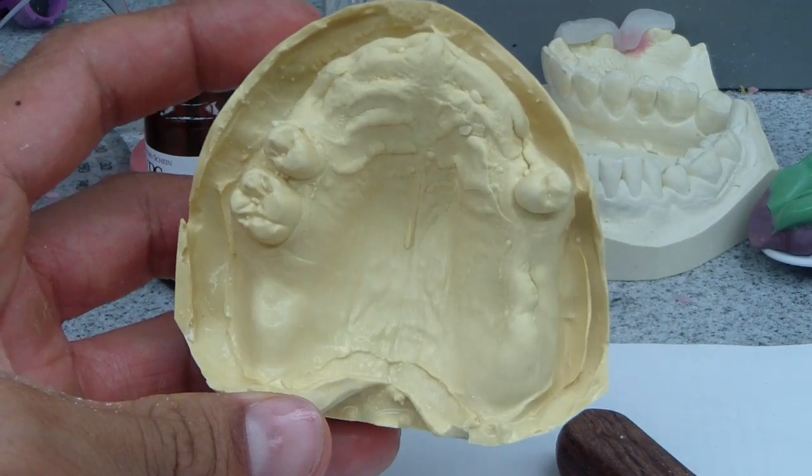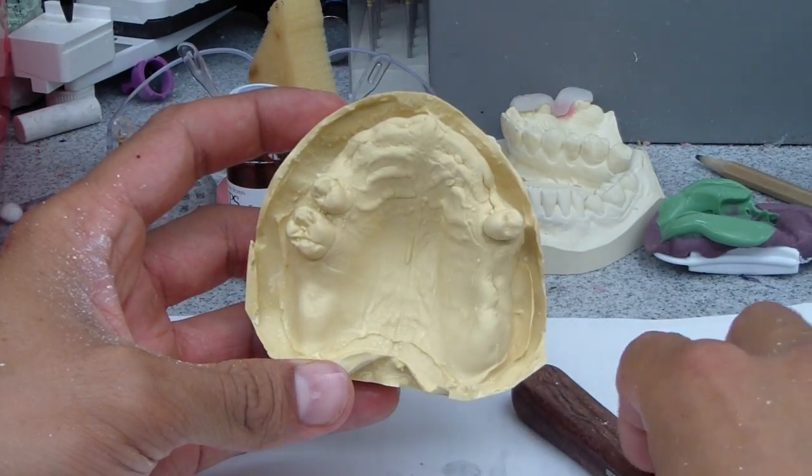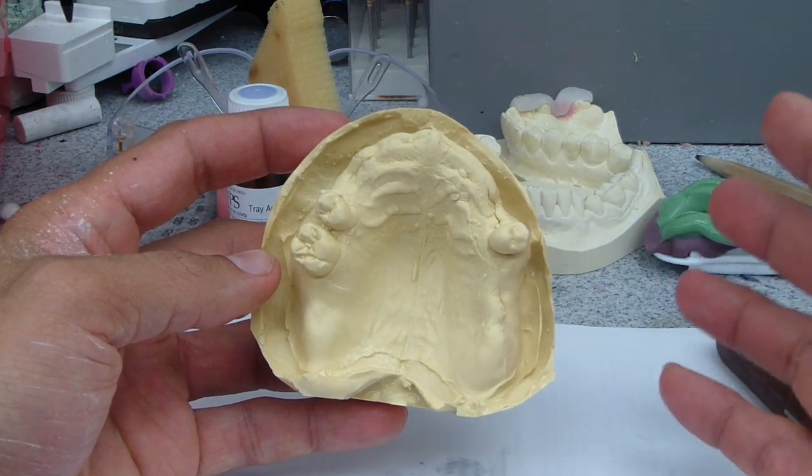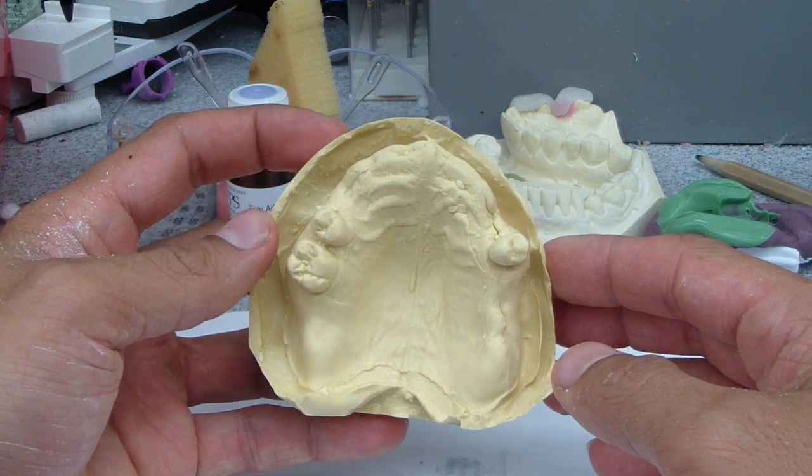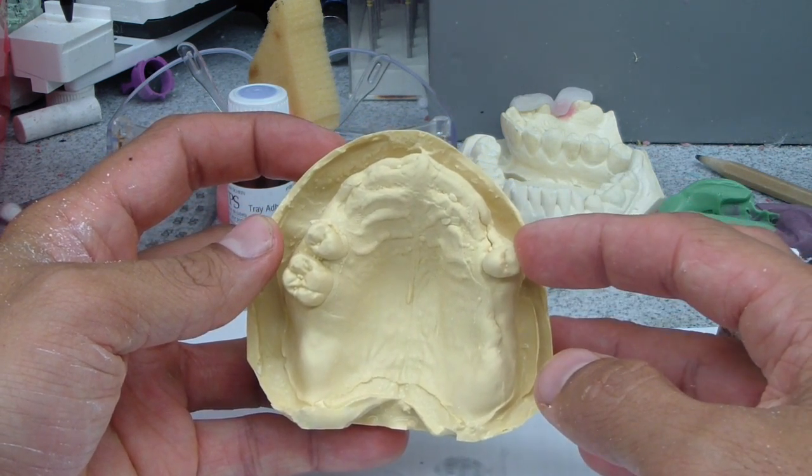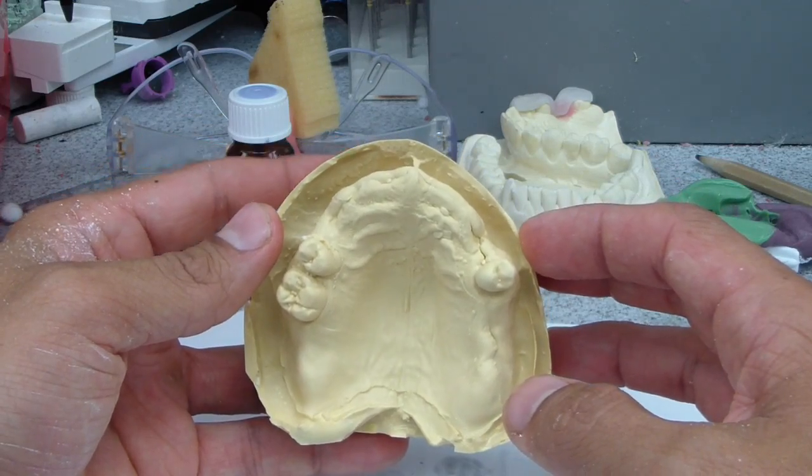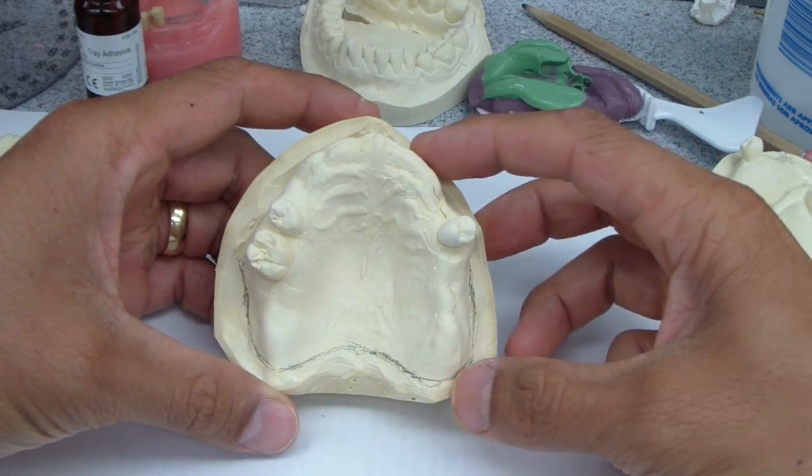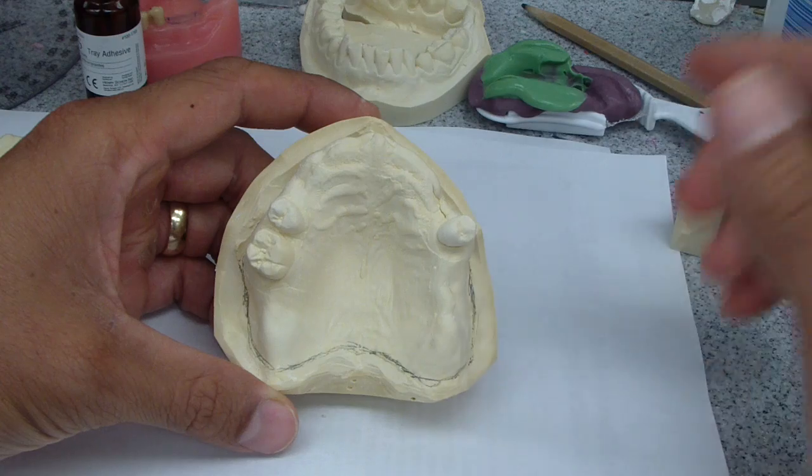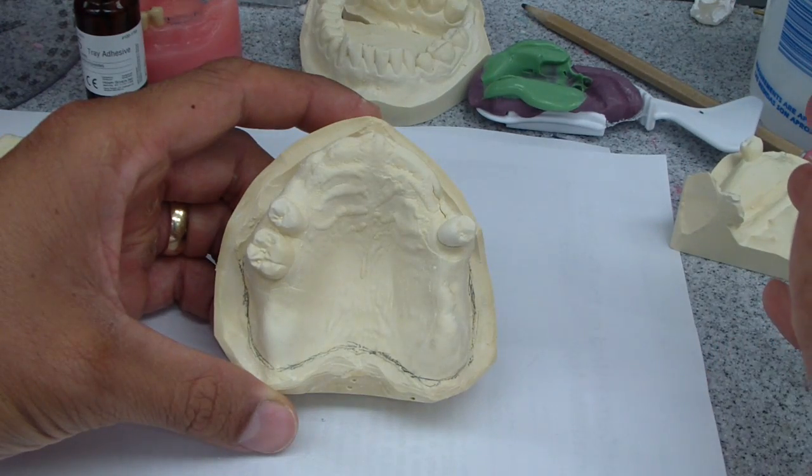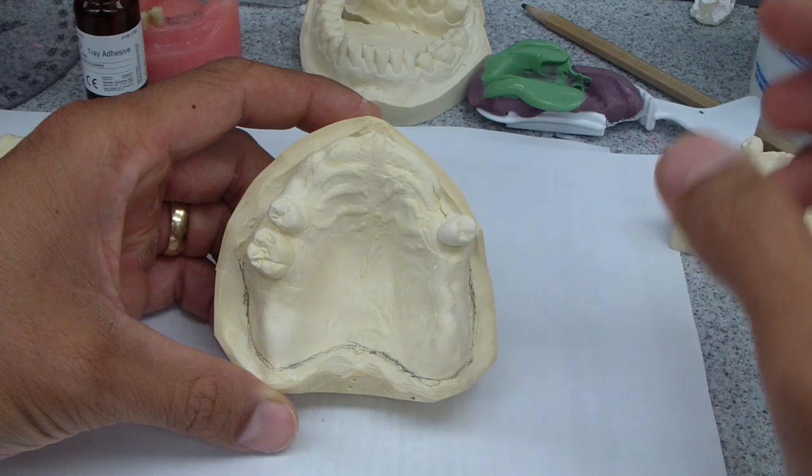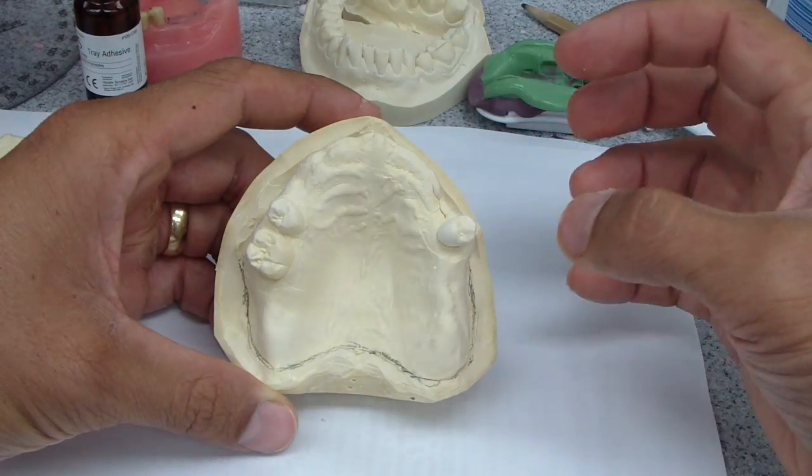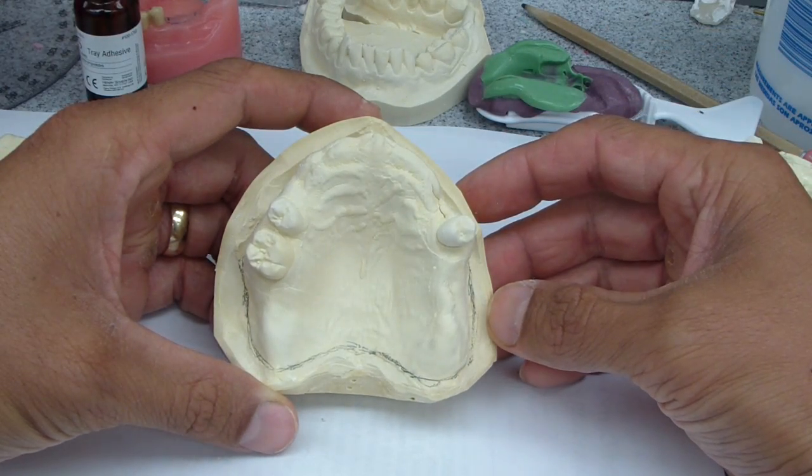So now we're just going to trim it back, and we're going to fabricate. The next stage is to fabricate a maxillary denture base and wax rims for maxillomandibular relationship record. And then we'll section the teeth and fabricate the immediate denture. And here we are. So this is now my master cast that we used, as you just saw, the procedure. And we did this in an effort to capture, as best as possible, the extensions of flanges or the borders of what will be our complete maxillary denture. And here we go.